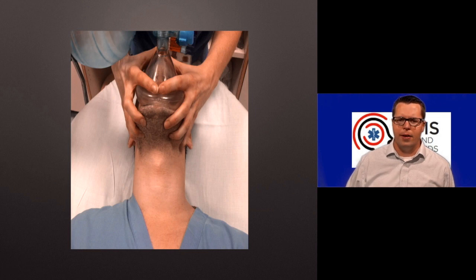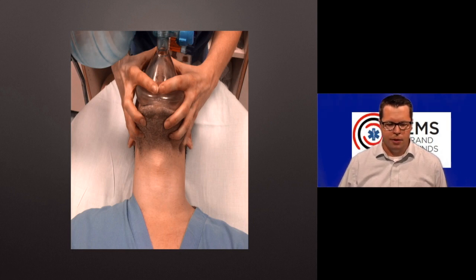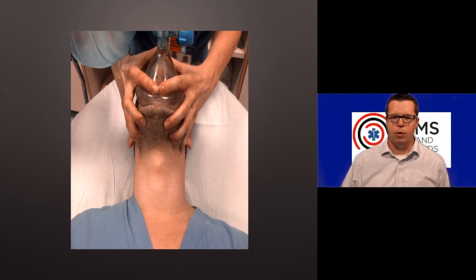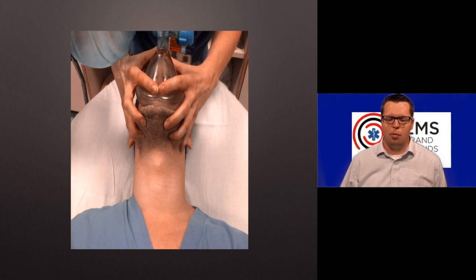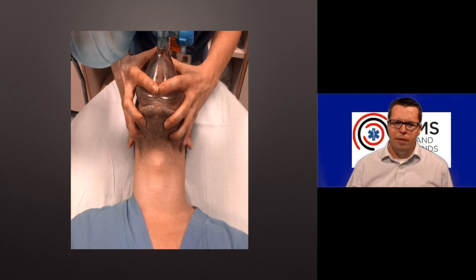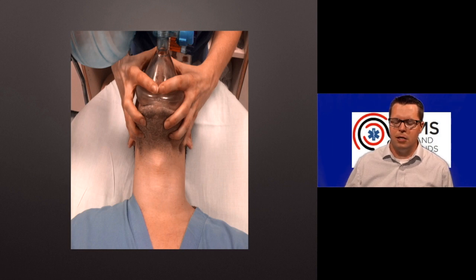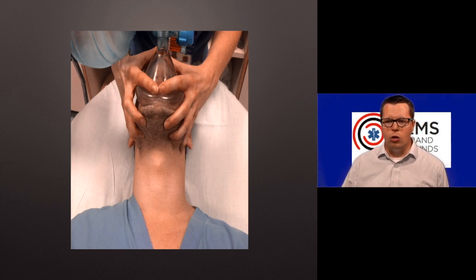If you don't have the advanced airway available, then it is super important that you use a two-handed grip. And the anesthesiologists out there, when I commented on this at one point on Twitter, were like, "Oh, we do this all the time." Okay. Great, good for you if you think you do, awesome. But I maintain that in the pre-hospital and emergency setting, none of us are good enough to do a one-handed mask seal for any length of time. You might be able to get a couple of breaths in, but not a substantial amount for a long period of time, especially when the patient's covered in blood and vomit and sweat and stuff. Anesthesia patients are fasted and clean, and generally we can control most of that. We are not in that situation. We don't have that luxury, so use a two-handed seal.